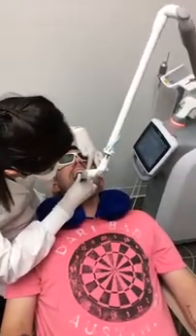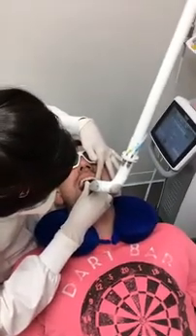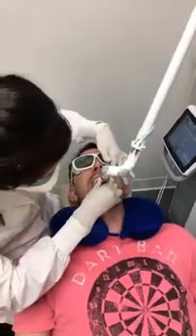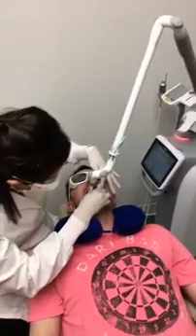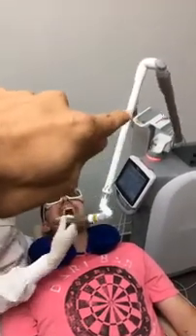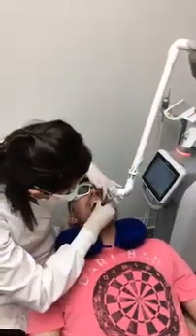So just in case our viewers are wondering, what we're doing here is we're shining this laser energy in the back of the airway, and we're causing the tissue to tighten up and to shrink and get less flapping. And that's how NightLase works. It's a dual laser thing, which means we've got one laser over there and we've got a second one over here. We start with that one and we go over here. And you can see that little green light there when she took it out.